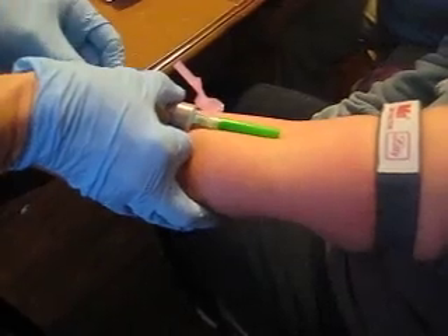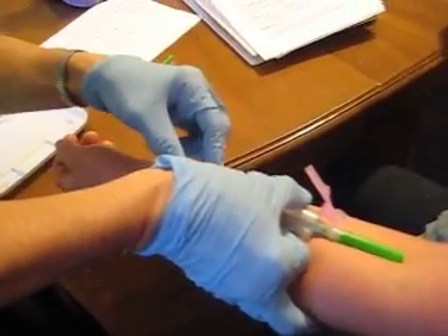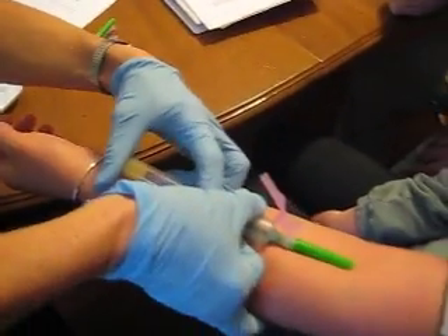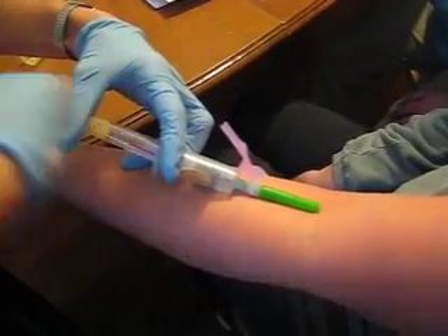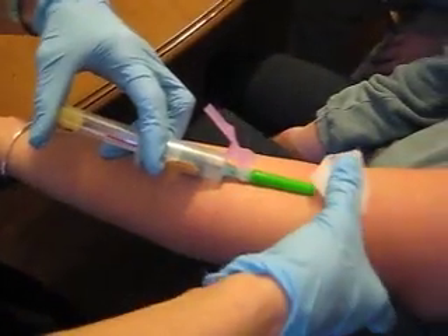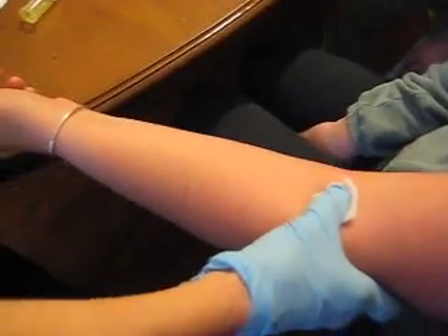The switching is the tricky part. Put it back on, and when the second or last tube is almost full, don't push down until you pull the needle out — because it'll hurt.